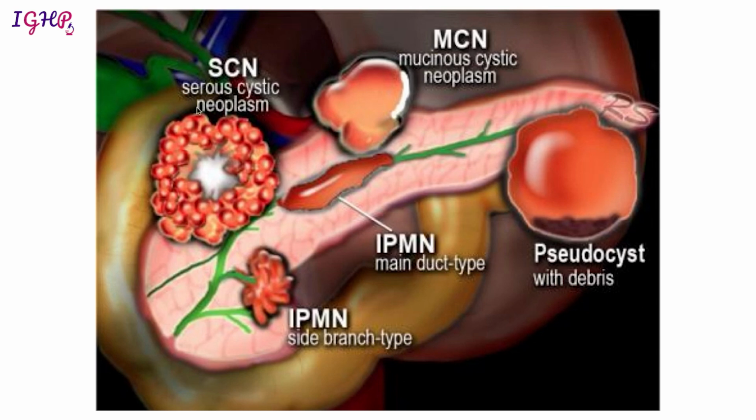The mucinous cystic and SCN, that is serous cystic neoplasm, both of them do not have any communication with the duct, whereas the IPMNs are seen within the duct, and could involve either the main duct or the side branches of the duct. So IPMNs are intraductal papillary mucinous neoplasms. So there will be papillae, there will be intraductal mucin, and most of these will show you ductal dilatation, whereas the mucinous neoplasm will have no connection with the duct, and the duct will be of normal caliber.